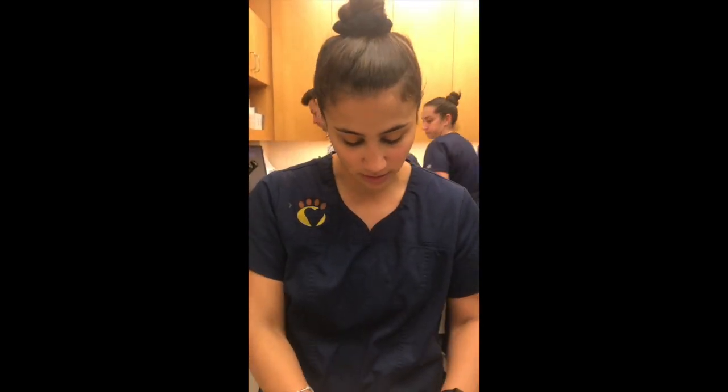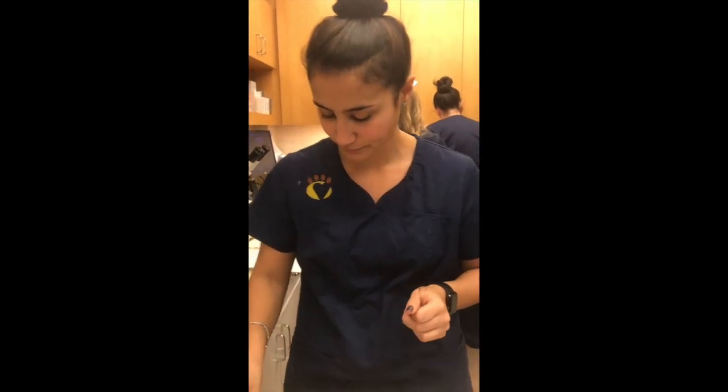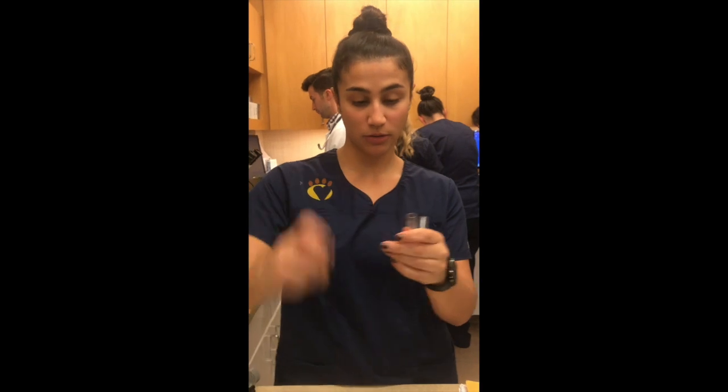And now I'm going to make our control recipient solution. So first I'm going to start with 2 drops of our 2% erythrocyte suspension from our recipient.